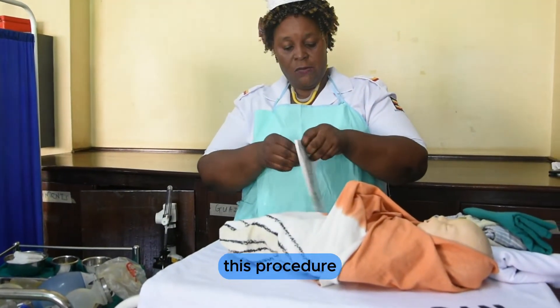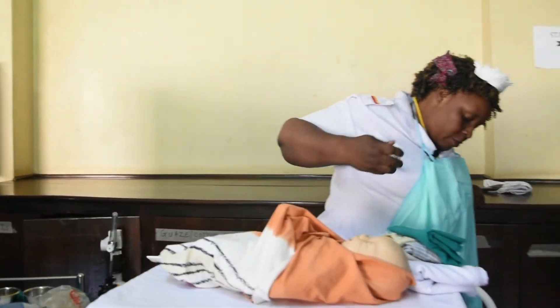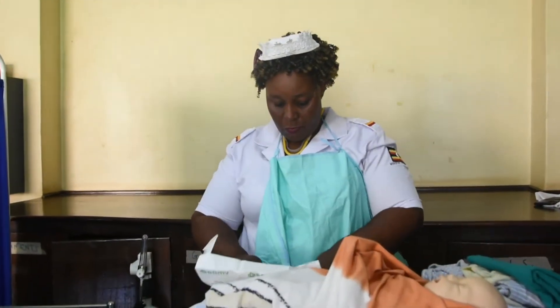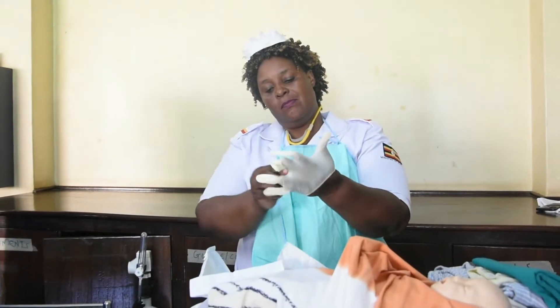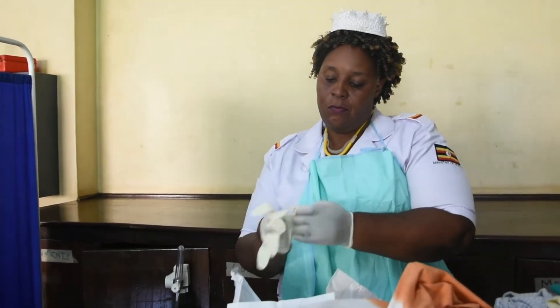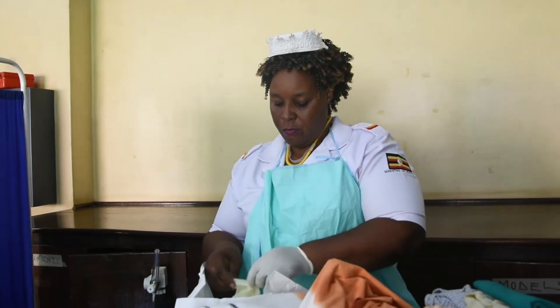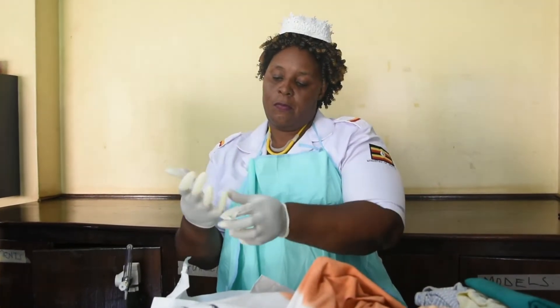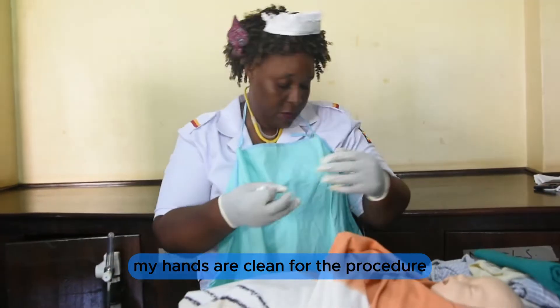I am going to put on surgical gloves because this procedure requires maximum infection control. My hands are now clean and gloved for the procedure.